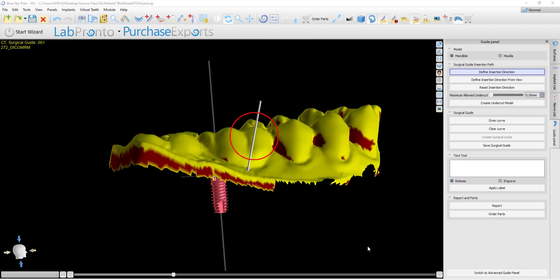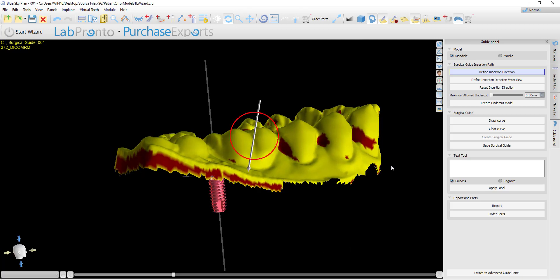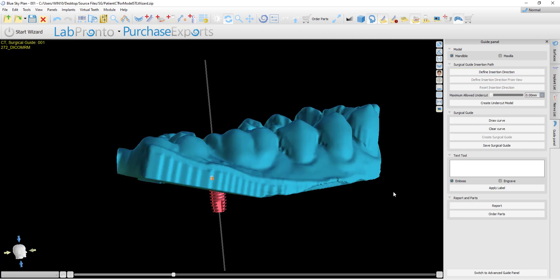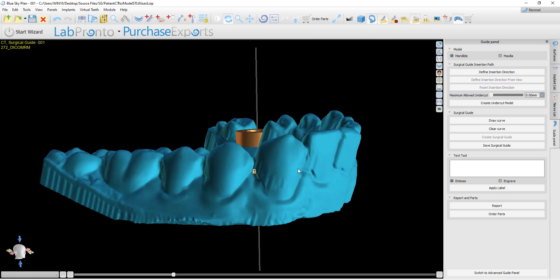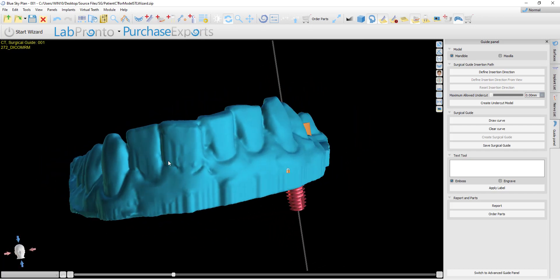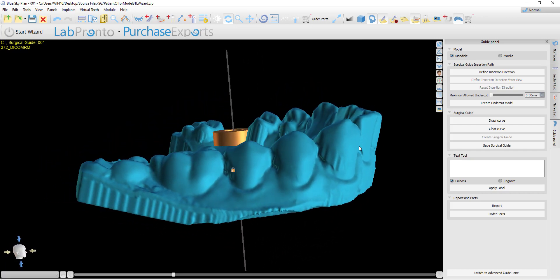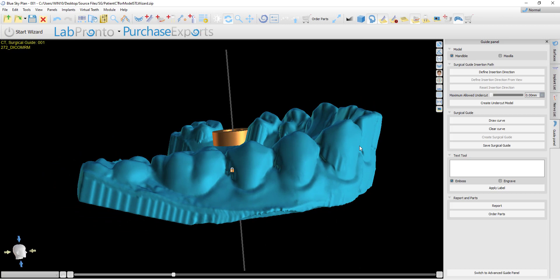What's very important to keep in mind here is that after you are satisfied with your insertion direction, you must click Create Undercut Model. This generates the model on which the surgical guide curve should be drawn and the surgical guide will be fabricated. This makes sure that the surgical guide will be inserted with the undercuts removed as the user has specified.